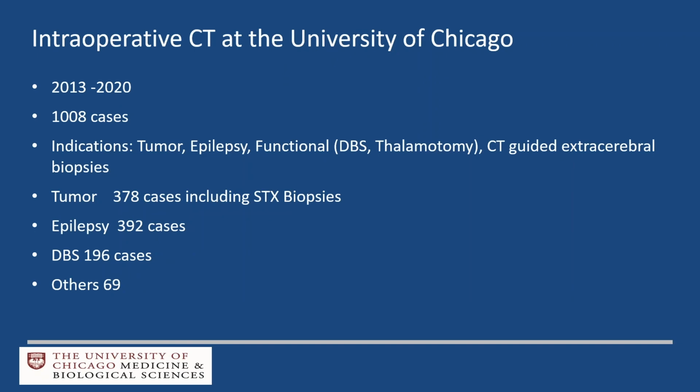So there's a summary. I think we're one of the first BodyTom users. From 2013 until January 2020, we've done 1,008 intraop CT cases. You see our indications are predominantly tumor, epilepsy, functional, and CT-guided stereotactic biopsies.